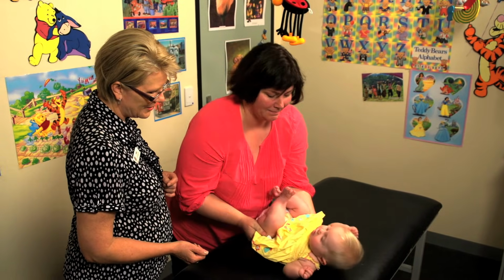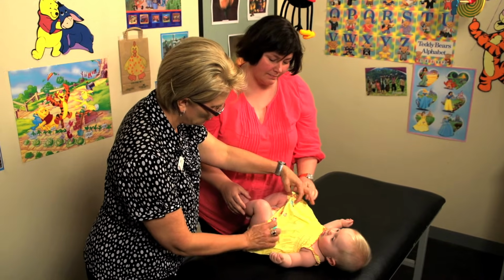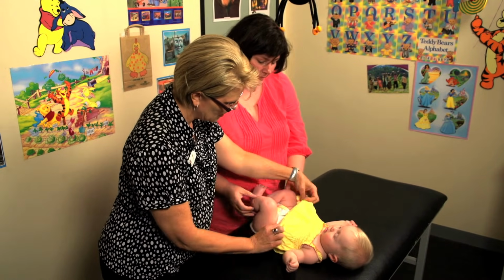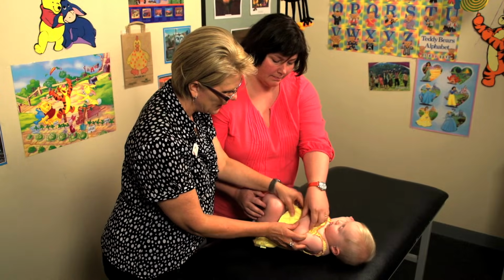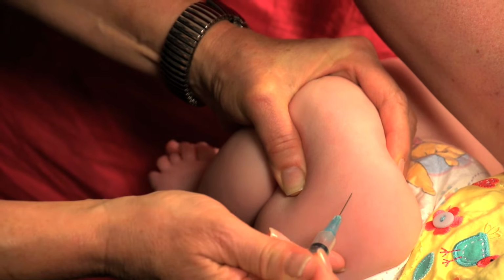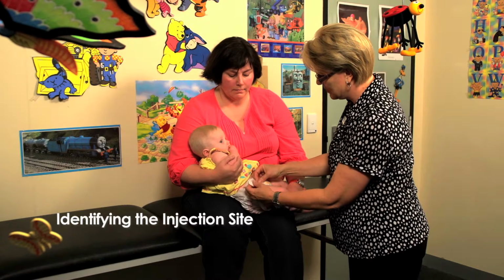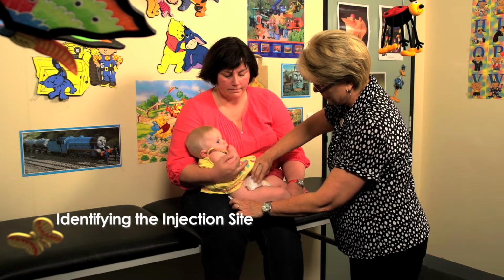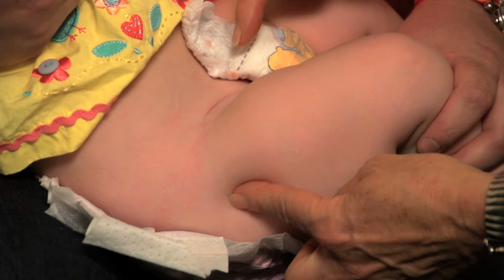An alternative to the cuddle position is to lay the infant on the examination bed, with the infant's head positioned away from you, and the carer standing beside you to immobilise and distract the baby. By cupping the patella in the non-injecting hand, you can keep the infant's hip and knee flexed prior to the injection. You may need to remove the nappy to properly identify the anatomical landmarks and fully expose the injection site.